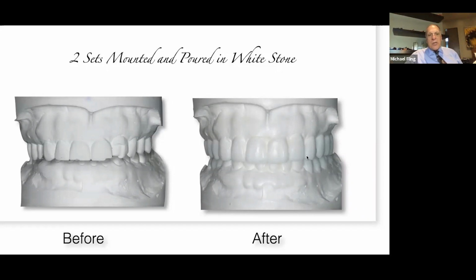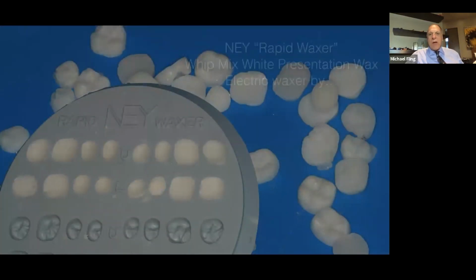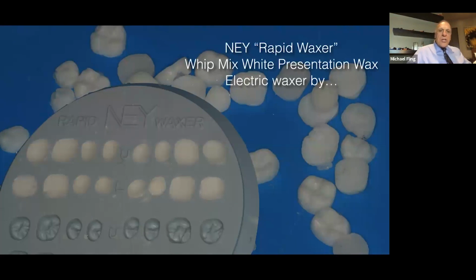So when I'm consulting with the patient, I have before and after. It's a really nice way to let your patient see what it's going to look like, and for you to understand what it's going to function like before you ever begin. So if you're going to do a wax up, here's what I will tell you. The anterior part is the difficult part to get done. Once I've got the anterior part done, waxing the back becomes really easy.